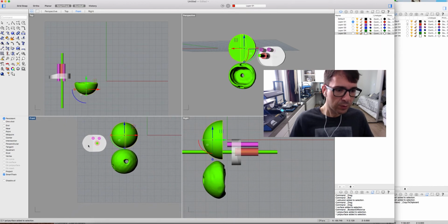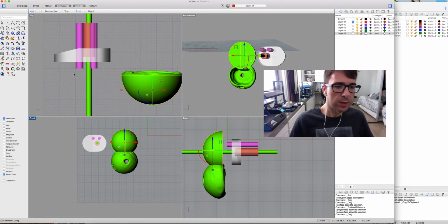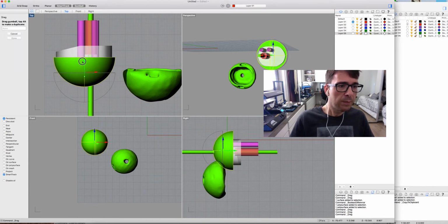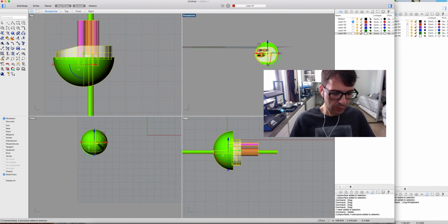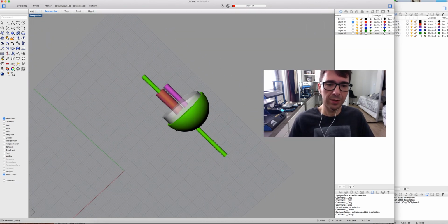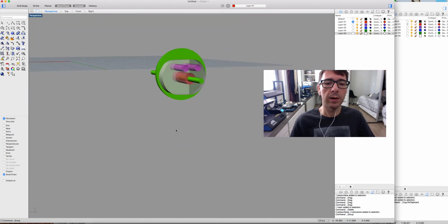Now we just have to move it to the central pin, so we can use this cylinder as reference because this will be in the center. It's not in the central pin, so we should move it to the center of our oval base plate, and here we have, I think we are done. Let's delete that. Let's group all together, and here we have our Exactech reverse total shoulder arthroplasty designed in 3D, and we can use it for any of our plans.